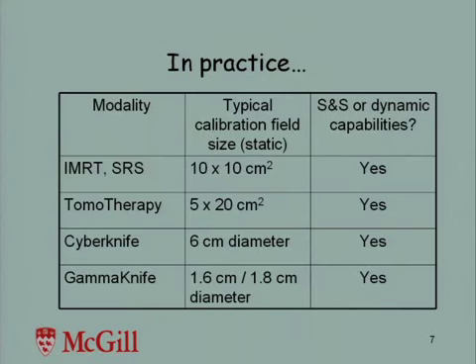Dosimetrically, what can we do with these machines, or how do we calibrate them? The standard accelerators can realize the standard reference field that is recommended in operating procedures such as, or codes of practice such as TG-51 and TRS-398. But obviously they operate mostly in clinical mode under dynamic delivery mode.